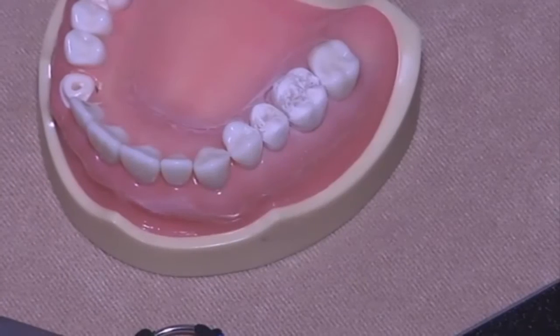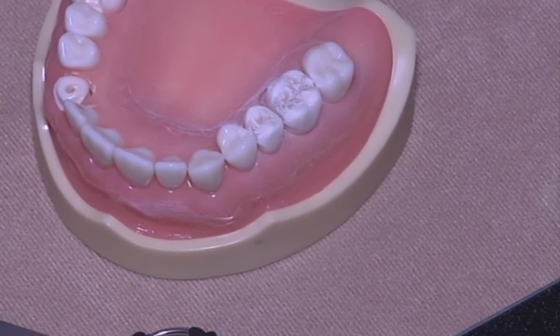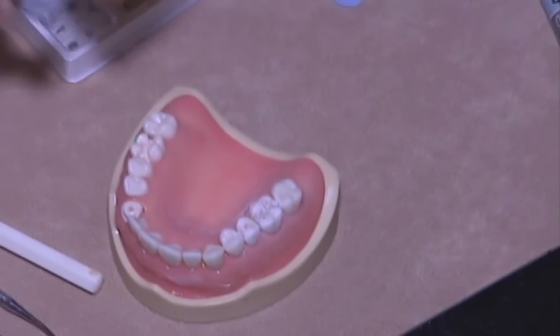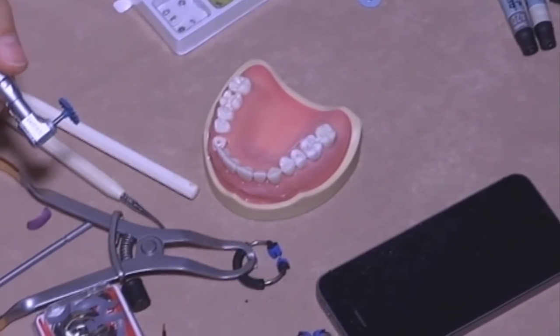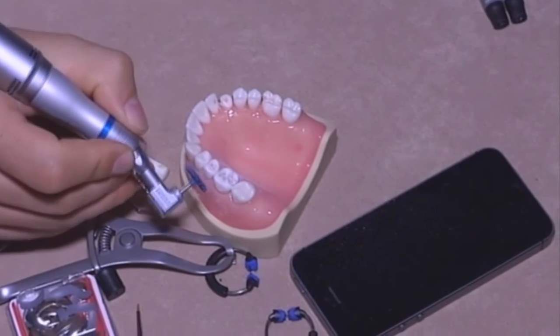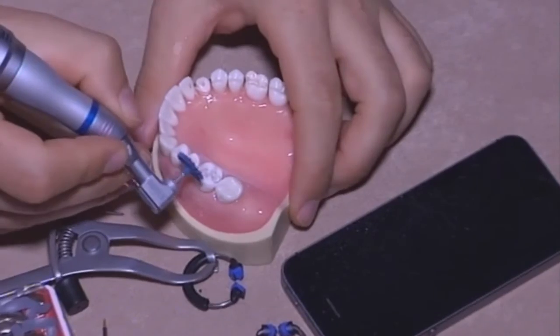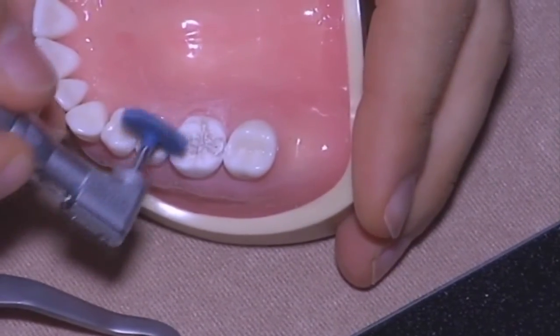Okay. Once the interproximal area is almost completed, you just need to move to polish. I was wondering when companies would give us proper polishing systems, because I think that all the shapes of the points before were not able to reach all the areas of the restoration, while the spirals like this, they can easily reach everywhere.